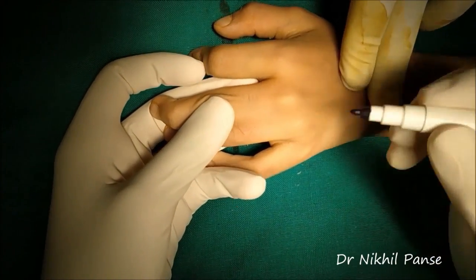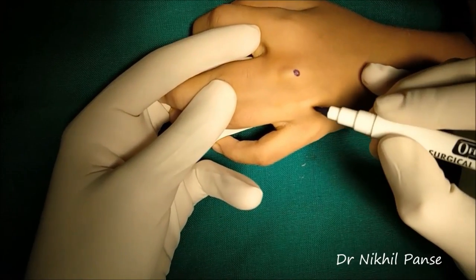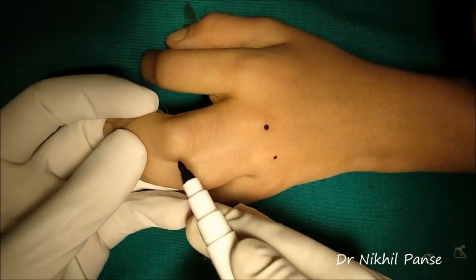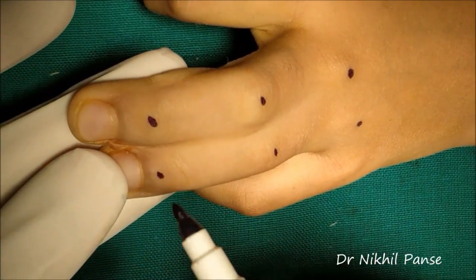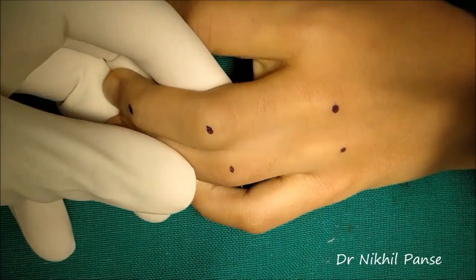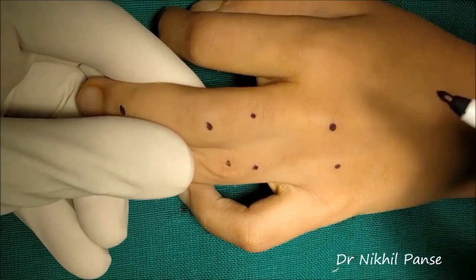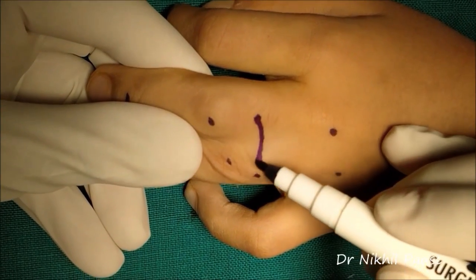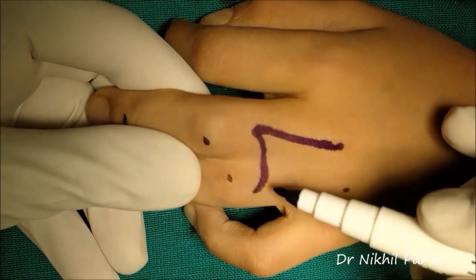Important bony landmarks are first marked — we are marking the metacarpal heads and other bony landmarks. The rectangular flap over the dorsum is designed from the metacarpal head to two-thirds the length of the proximal phalanx. We have approximately marked the two-thirds length of the proximal phalanx, and this is the rectangular flap which is being marked.